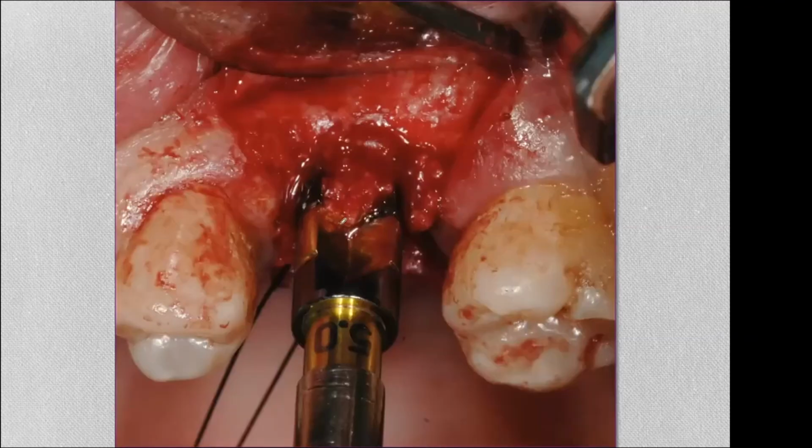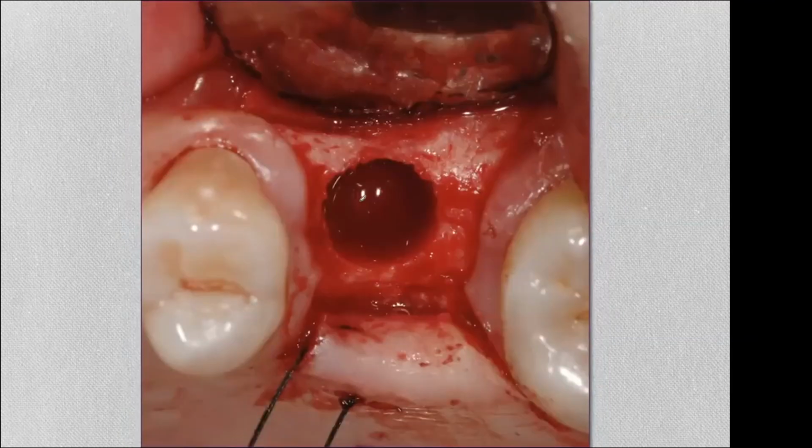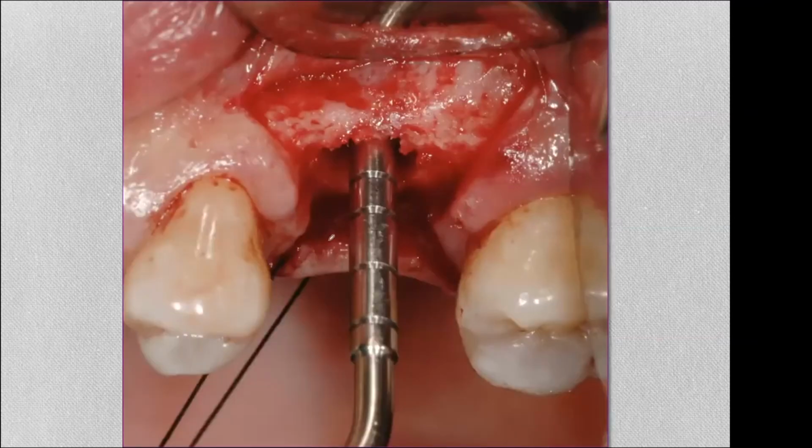Here's a 5 millimeter reamer. Again, notice how much bone is coming out. All right, and now we take an occlusal view of this, okay? The palatal bone at the crest is right here. It's about the same thickness. I don't want to have the distances, so I had to sort of split the difference. Now, when you look at this, it looks like it's a little bit more mesial, okay? And with all of our measurements and everything, what happens is the bone is a little denser on the distal. So it moved us ever so slightly, and yet we will use one of the advantages of the Bicon system and make sure it fits.